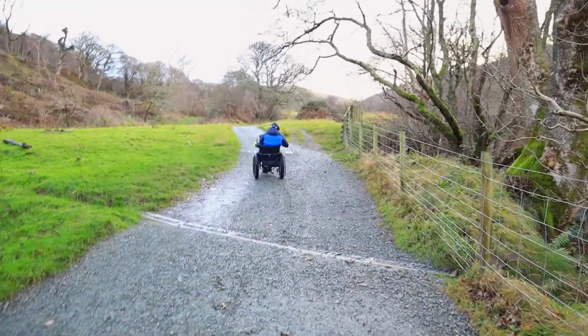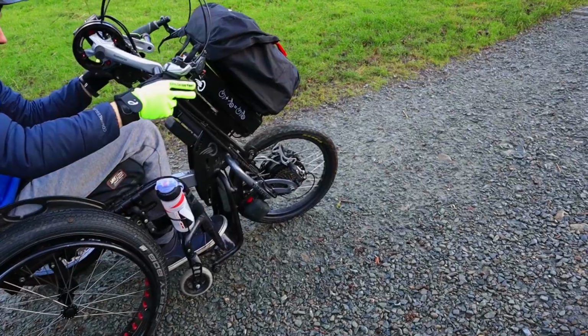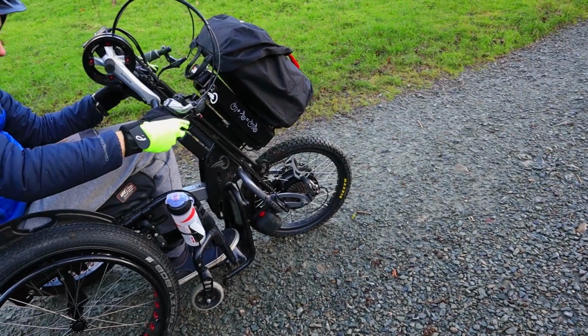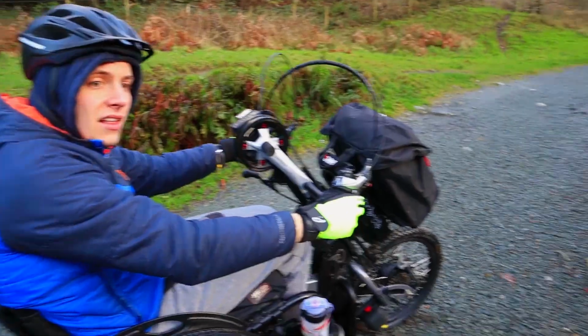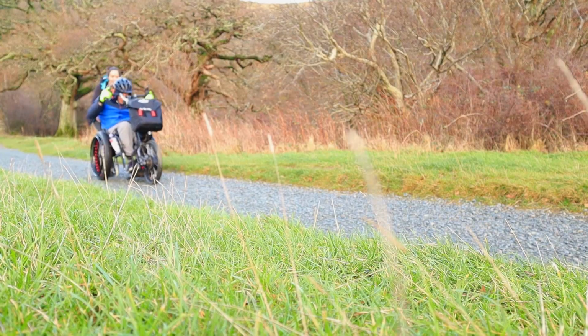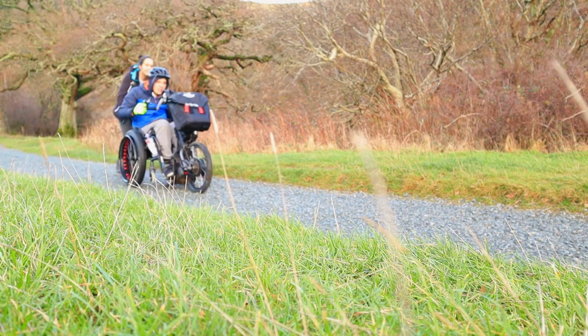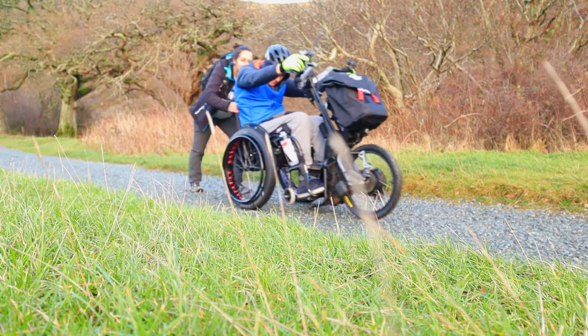Ooh, losing grip. Too gravelly, and basically the wheel just spins and then starts to skid backwards, which means that we might need to do a combination of Craig using this and then me also pushing him from behind at the same time to make it. So we just came up this hill, which was a little bit difficult, and I needed to push Craig the whole way up the hill, but it wasn't that bad. We made it. This is the worst bit.